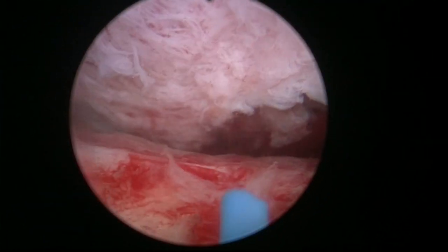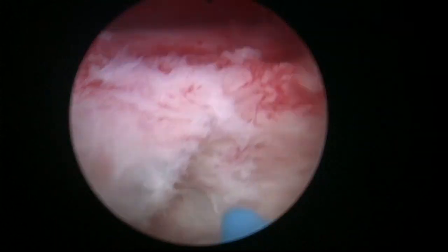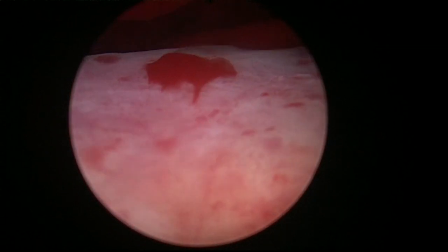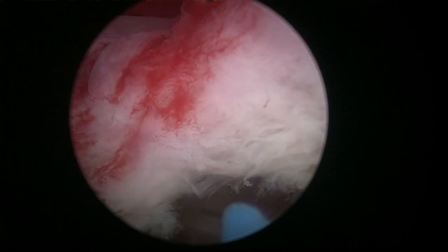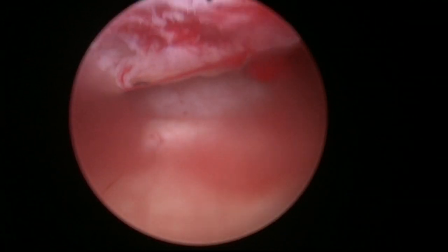Some oozing still. Okay, I think it's probably good enough. Let's see if we find any major vessels. Well, here it is. It's quite far. In this view, it looks much closer and very frightening, but you have to be careful, of course. We can coagulate here a little bit more, and let's morcellate it. I'm going to take out the fiber.